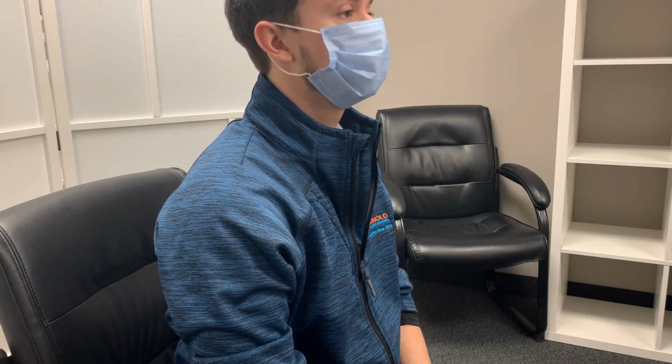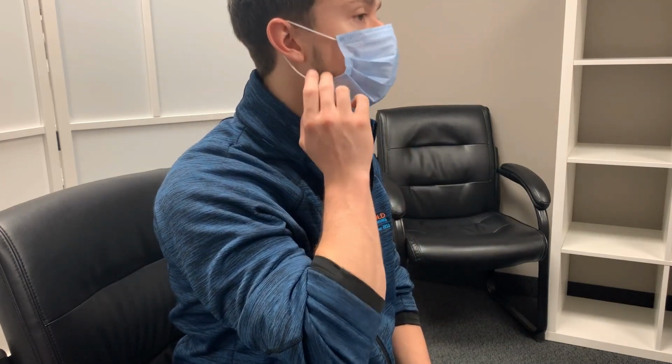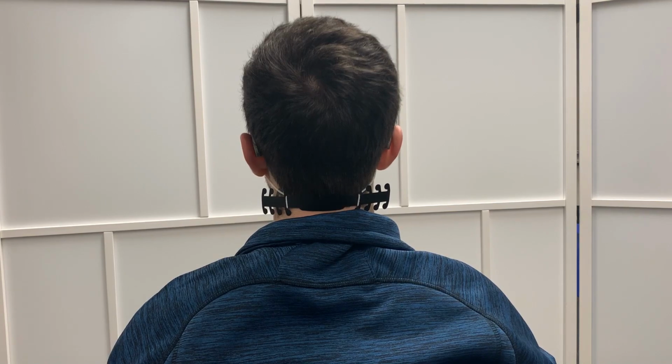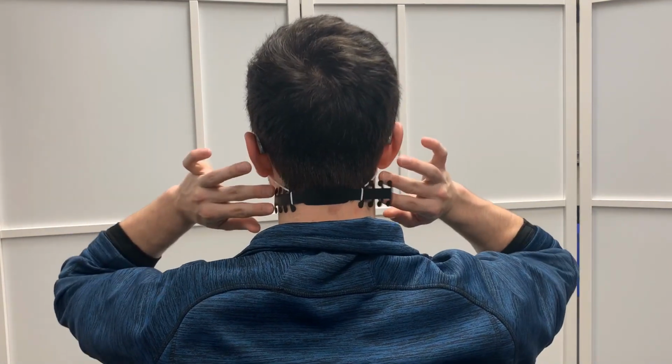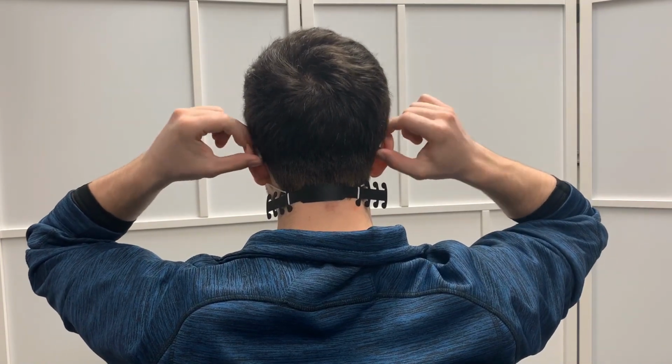Though we understand that wearing a mask and hearing aids can still be difficult. Here are some tips and tricks to give you some relief behind your ears. The first option is the ear saver. It reduces the irritation of the elastic against the ear while allowing the hearing aids to sit freely.